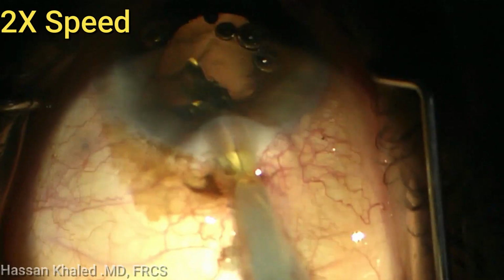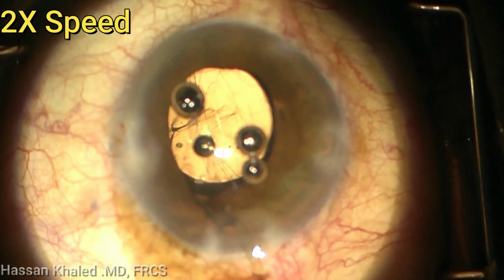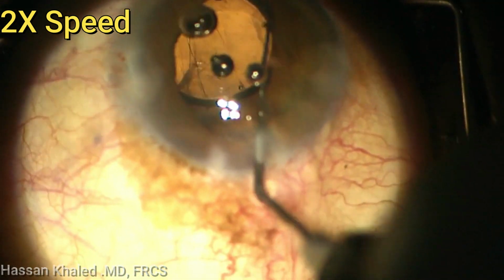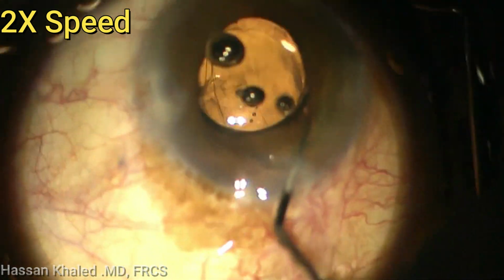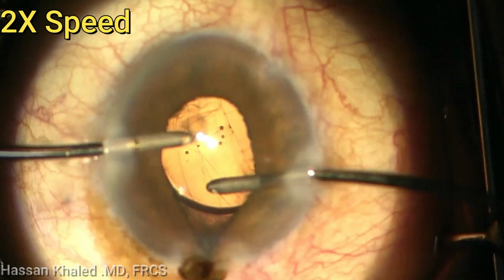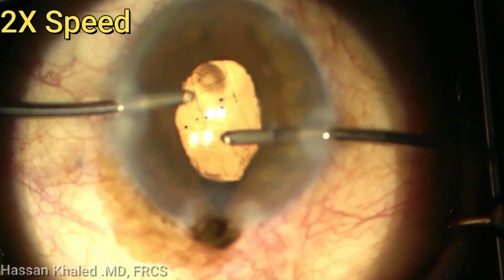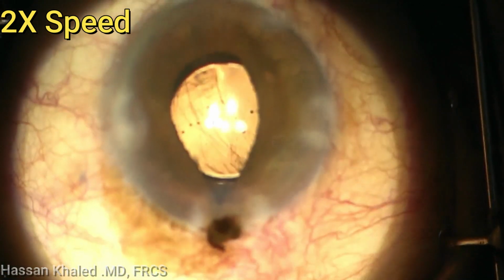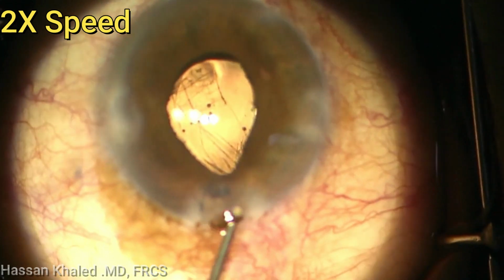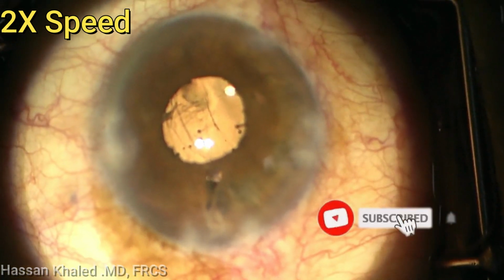Now here is the cohesive to implant the IOL. Actually, it's very important in a case like this to implant a 3 piece IOL, but unfortunately the proper power for this case wasn't available, so I found myself obliged to implant a single piece IOL. The IOL was implanted with the haptics in the sulcus. Actually, I have many cases with single piece and I have very good results, but it's much better to implant the 3 piece IOL with the haptics in the sulcus.